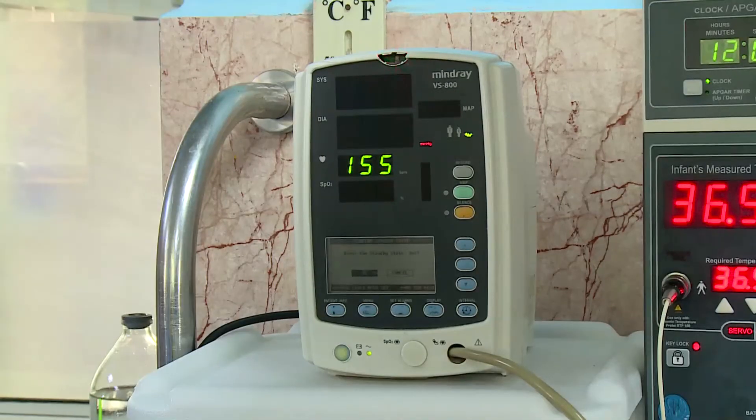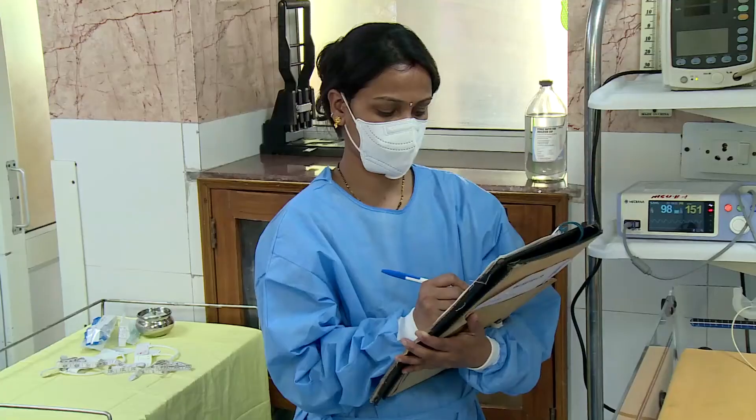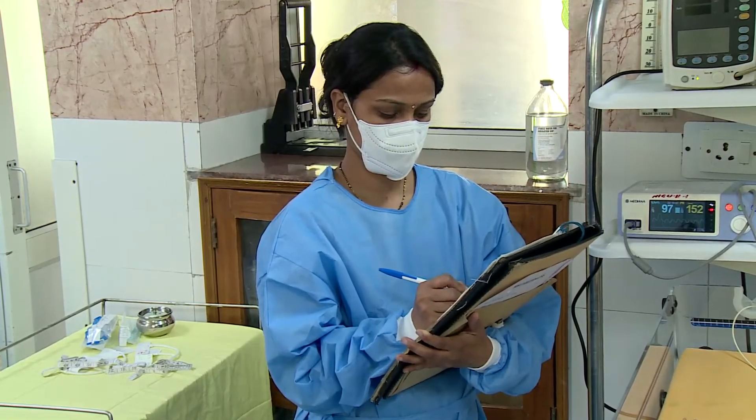Take the mean of three readings taken at two-minute intervals. Record the non-invasive blood pressure reading.